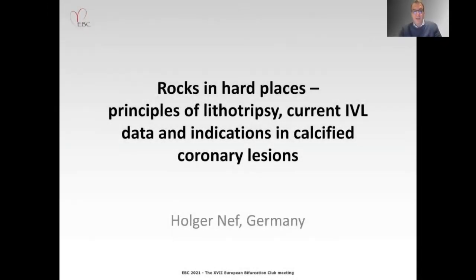Dear Chairman, thank you for the invitation to present at the EBC 2021. The title of my presentation is Principle of IVL, Current IVL Data and Indications in Calcified Coronary Lesions.